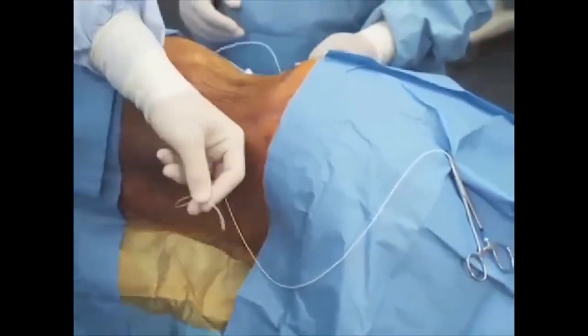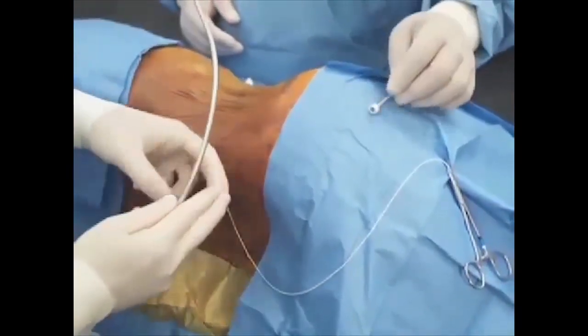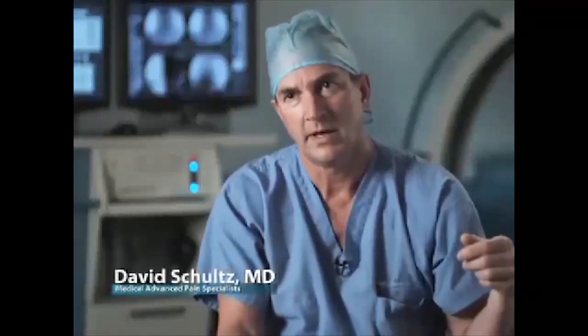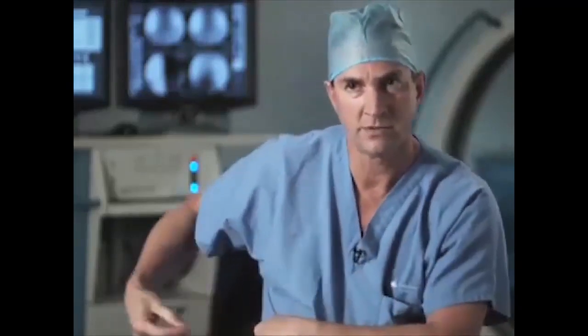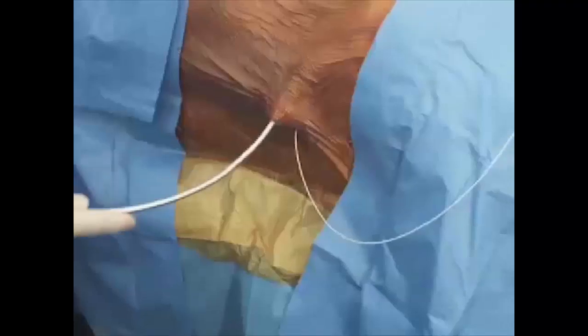You guys have this really nice tunneling device that is easy to use, very malleable, and I use that almost on every tunneling case. And if I'm going from the spinal site to the pocket in the abdomen, I try to make one tunnel rather than bring the device out through a separate incision. And in most people, the tunneler is so malleable that I can thread it from the spine all the way to the pocket with one pass.